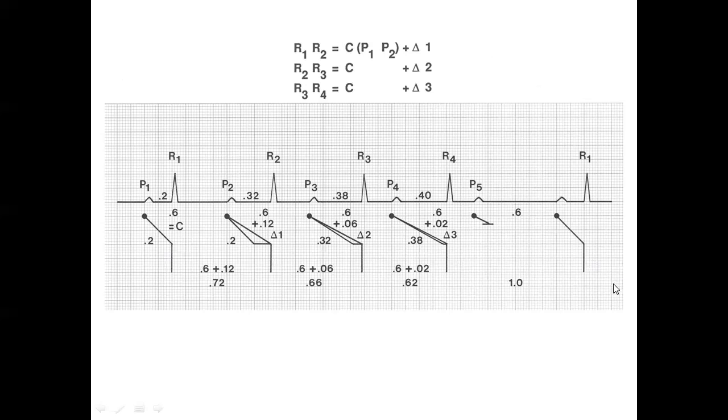I would call that a secondary characteristic, and you wouldn't need that in AV Wenckebach phenomenon because the progressive lengthening of the PR interval is so obvious. So you don't need any other characteristics. But if you are dealing with the SA Wenckebach phenomenon, or junctional rhythm Wenckebach phenomenon, or atrial flutter with the Wenckebach phenomenon, then this second characteristic will become very handy.